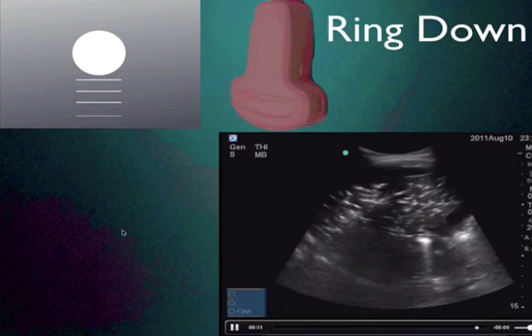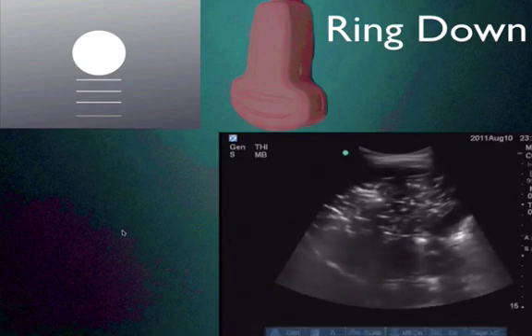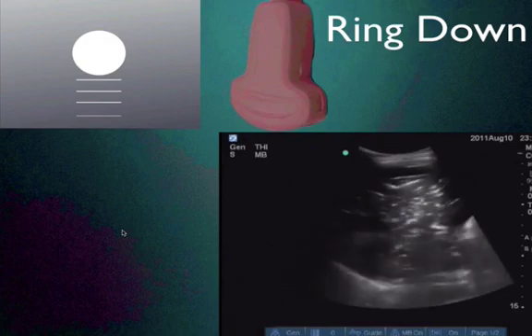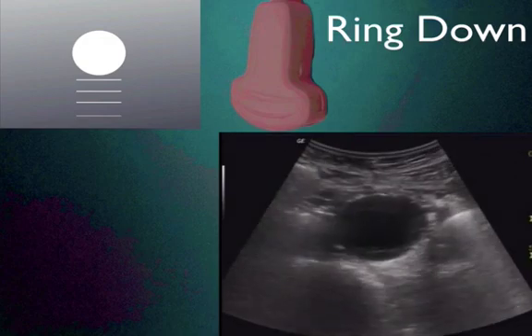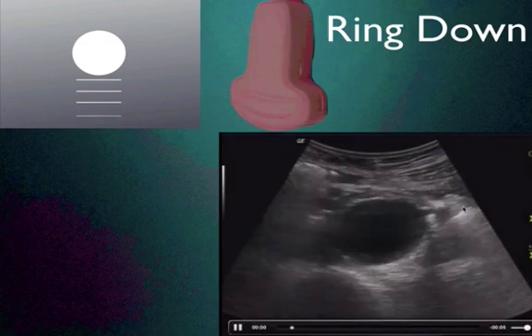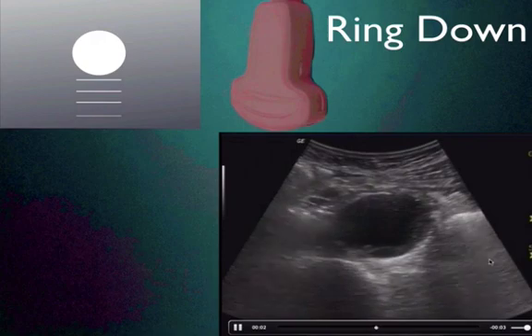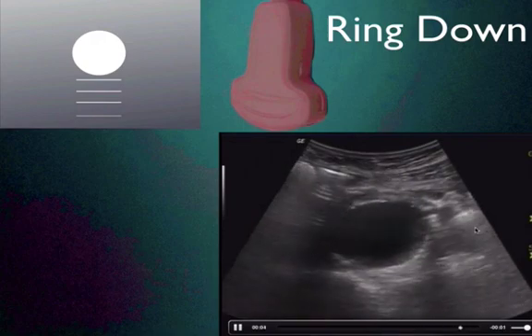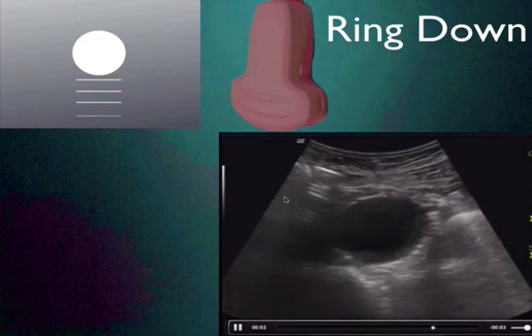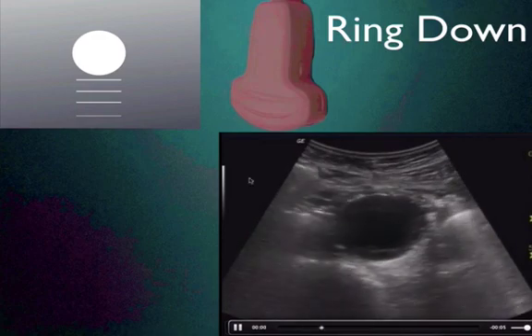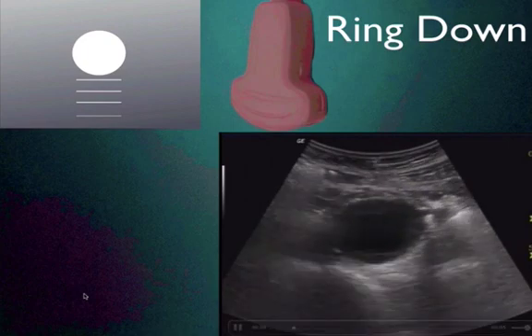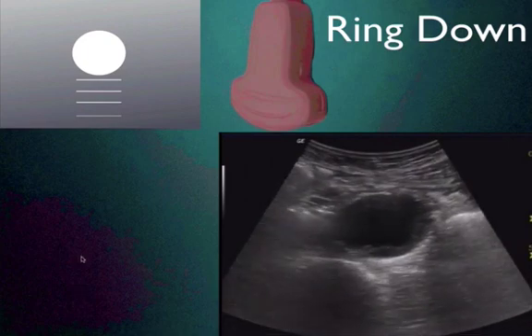That is the reason that air is often called the enemy of ultrasound — because you really can't ultrasound through air. Here's another example: this is an abdominal aortic aneurysm, but if you look to either side, you can see that ring down artifact coming off of the gas in the loops of bowel, giving this dirty shadowing on either side. This is also often called air artifact.